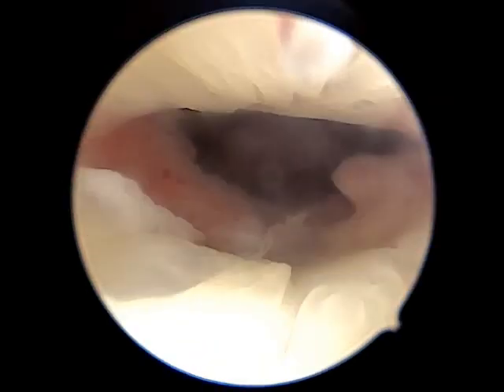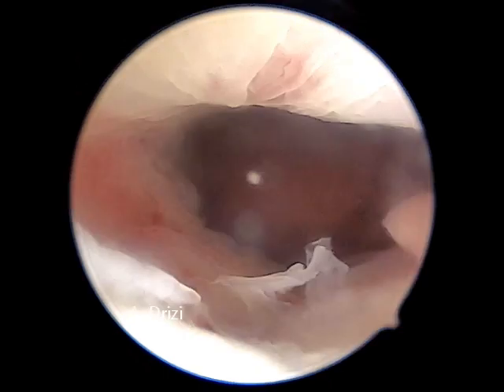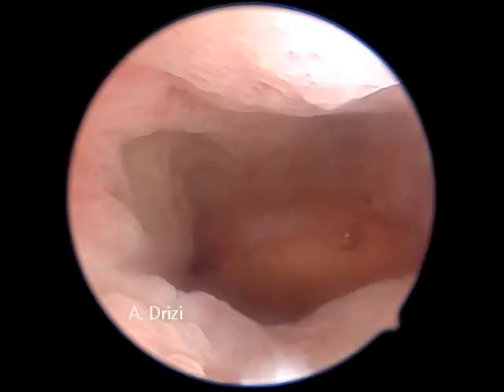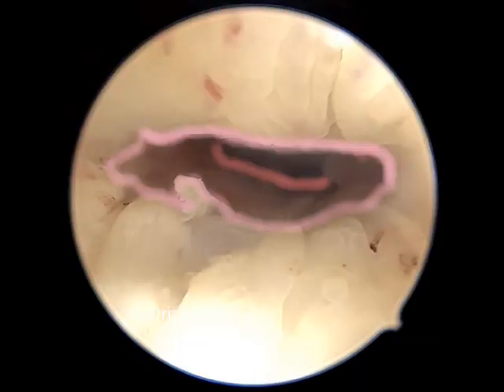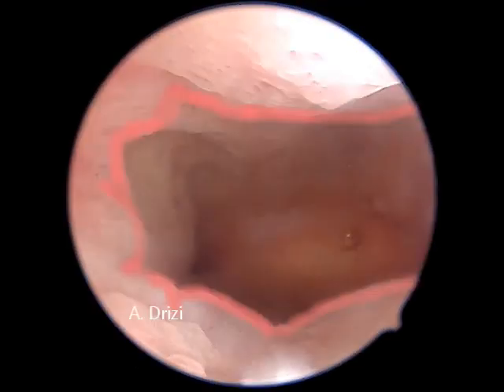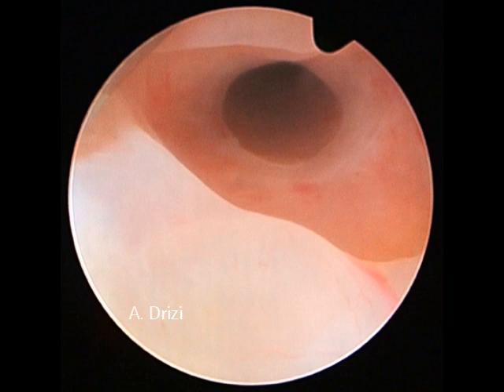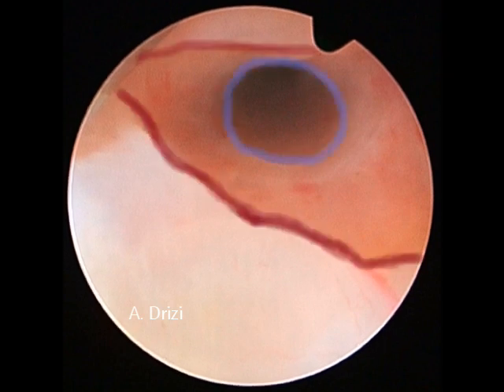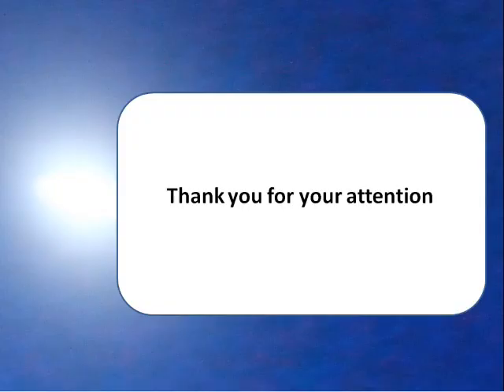Again, to demonstrate the second ostium of the isthmus, it is very important to enter the cavity in a slow and gentle fashion; otherwise the odds of missing it are great. I look forward to viewing isthmus images from colleagues. Thank you for your attention.